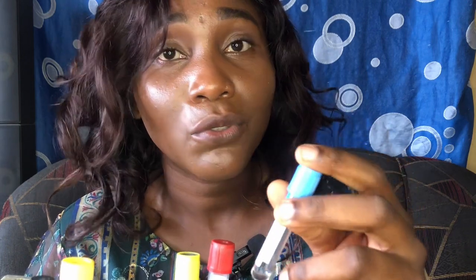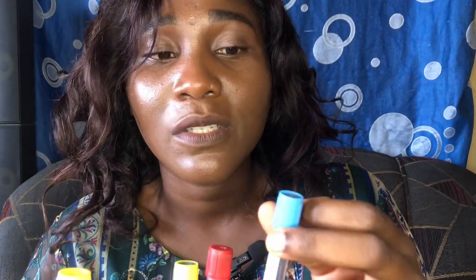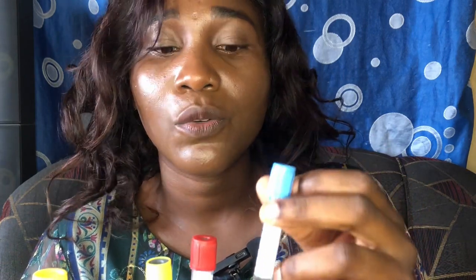If you are asked to do a PT test, make sure it's a prothrombin time test, not a pregnancy test, because they can sound alike. This is the tube you would be using. After the blood culture collection, which is the sterile collection and the first draw, the second draw is this light blue top tube.